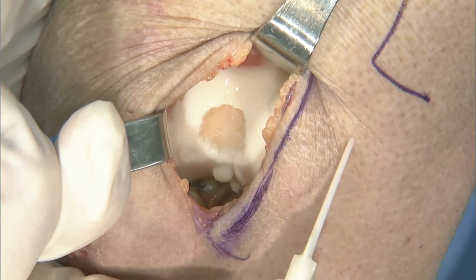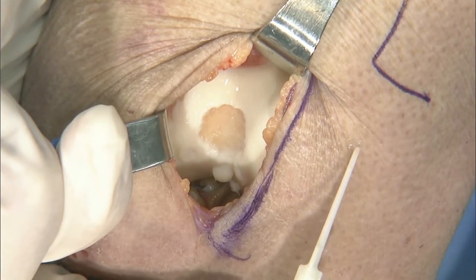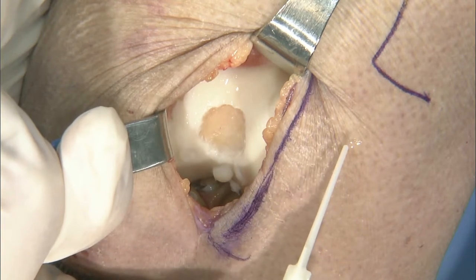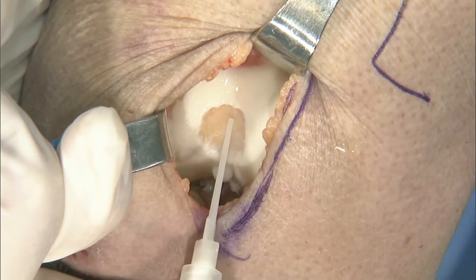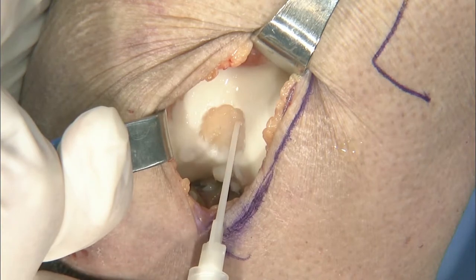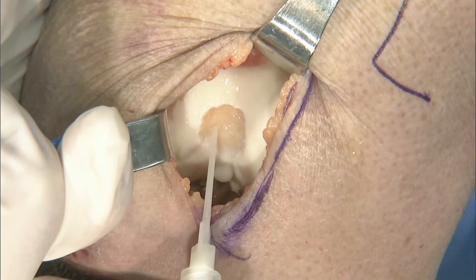So I'll play with it a hair just to make sure that I have a good understanding of what I think that's going to do. Once I have an understanding of what it's going to do, I basically will get a little ball of it to the tip, and then I'll start putting it into the defect, just really slowly kind of painting it in there.